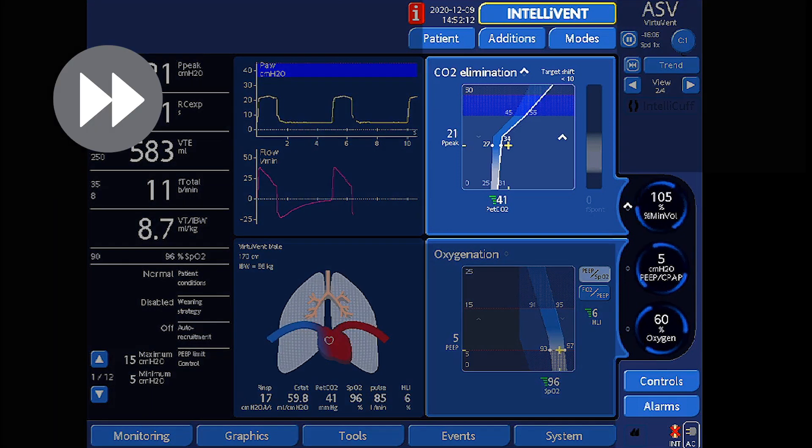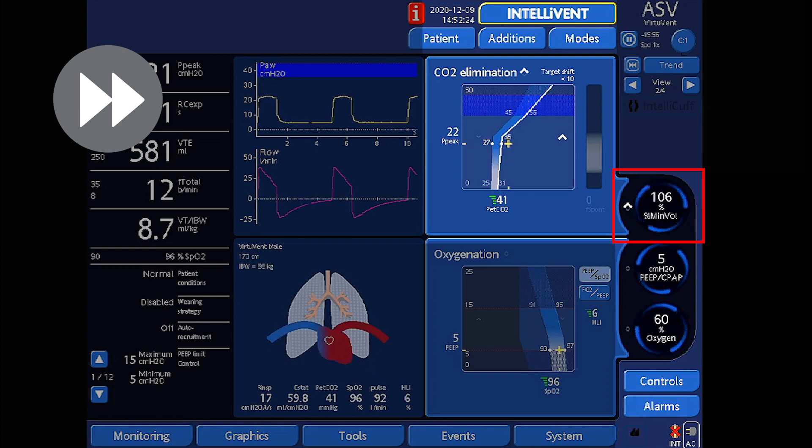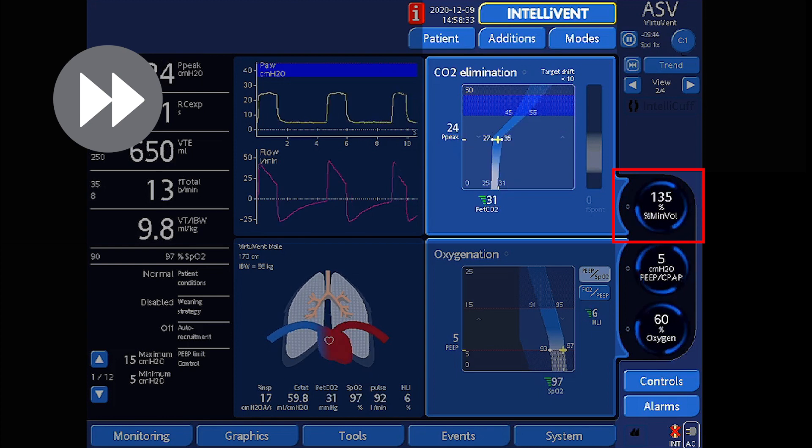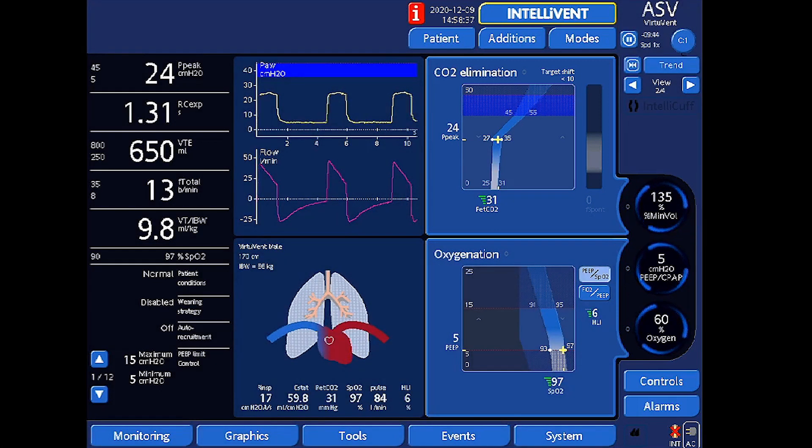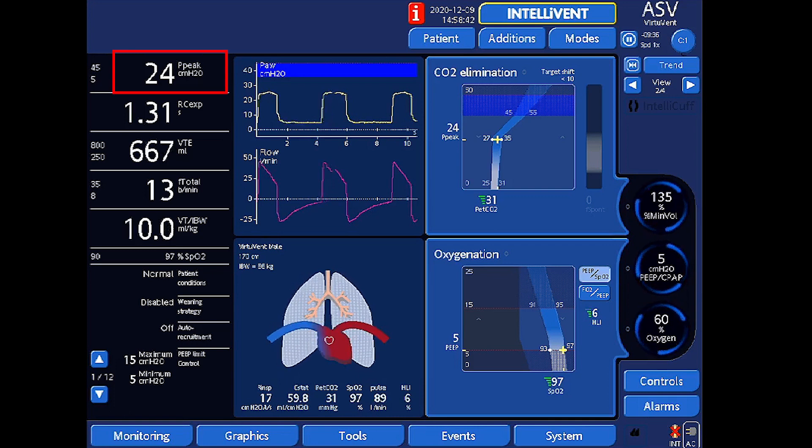The time-lapse shows you how IntelliVent ASV now adjusts the percent minute volume by a maximum of 1% per breath to bring the patient's PET CO2 value into the new target range. With the increase in percent minute volume, the peak inspiratory pressure has increased as well, so the target range has changed slightly to between 27 and 35 mmHg.